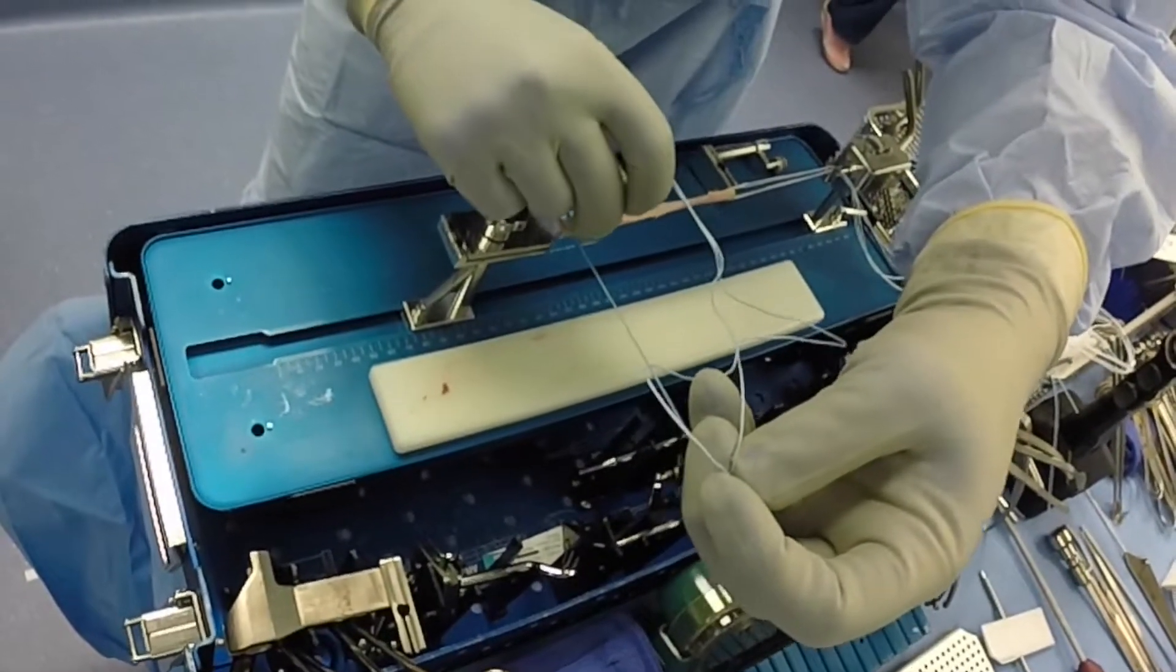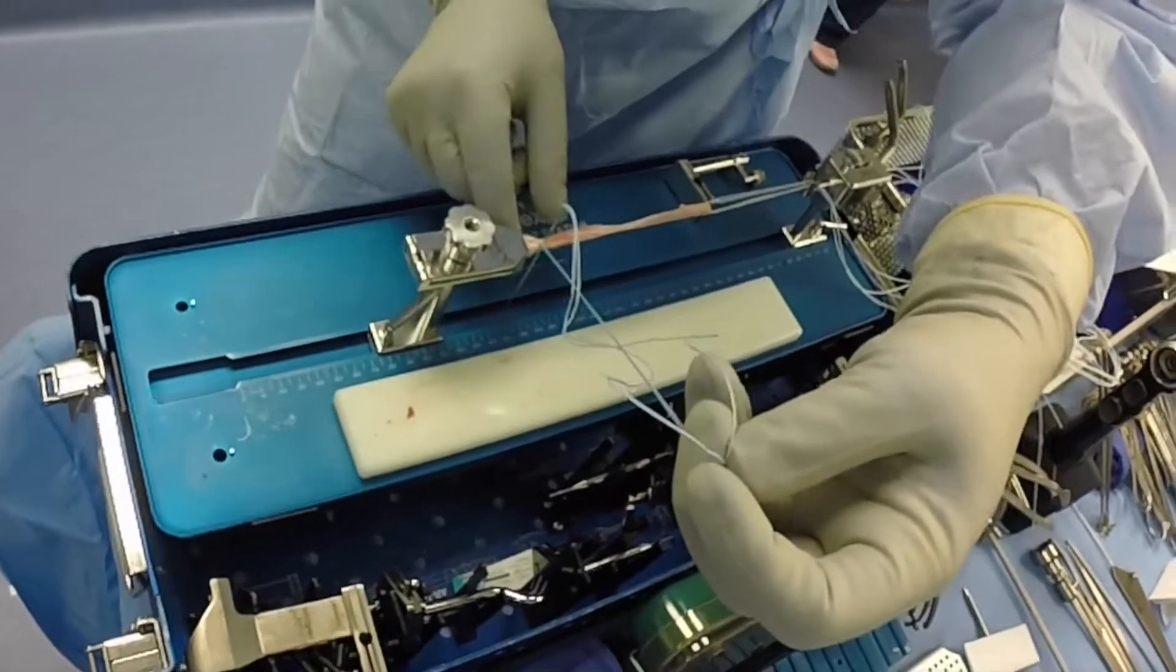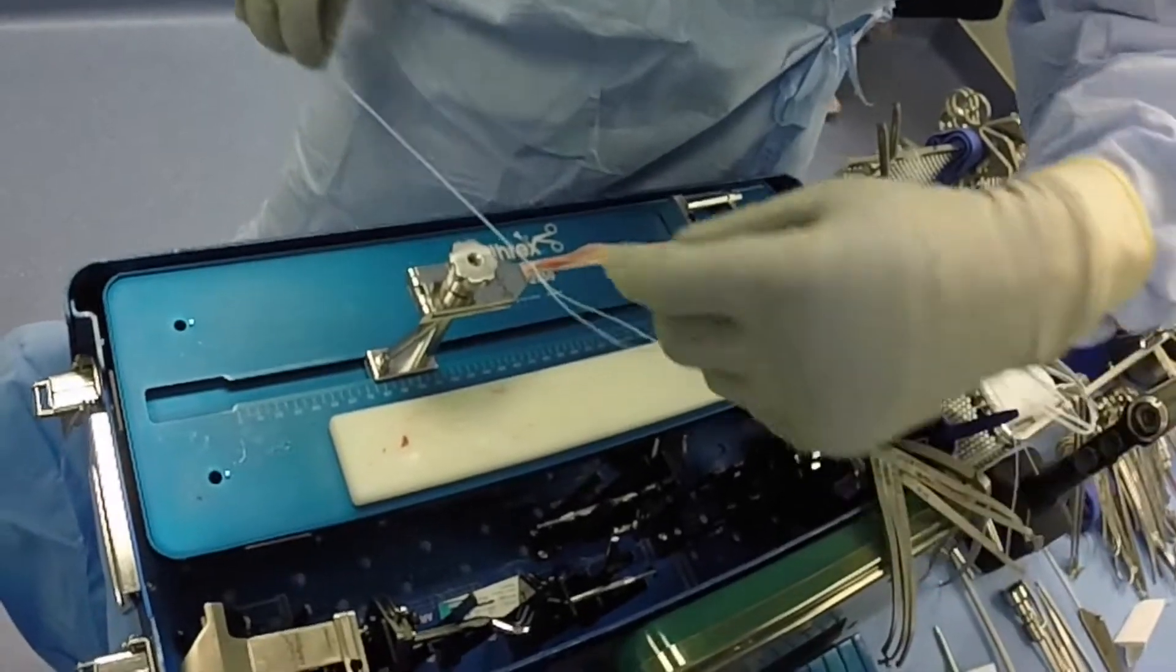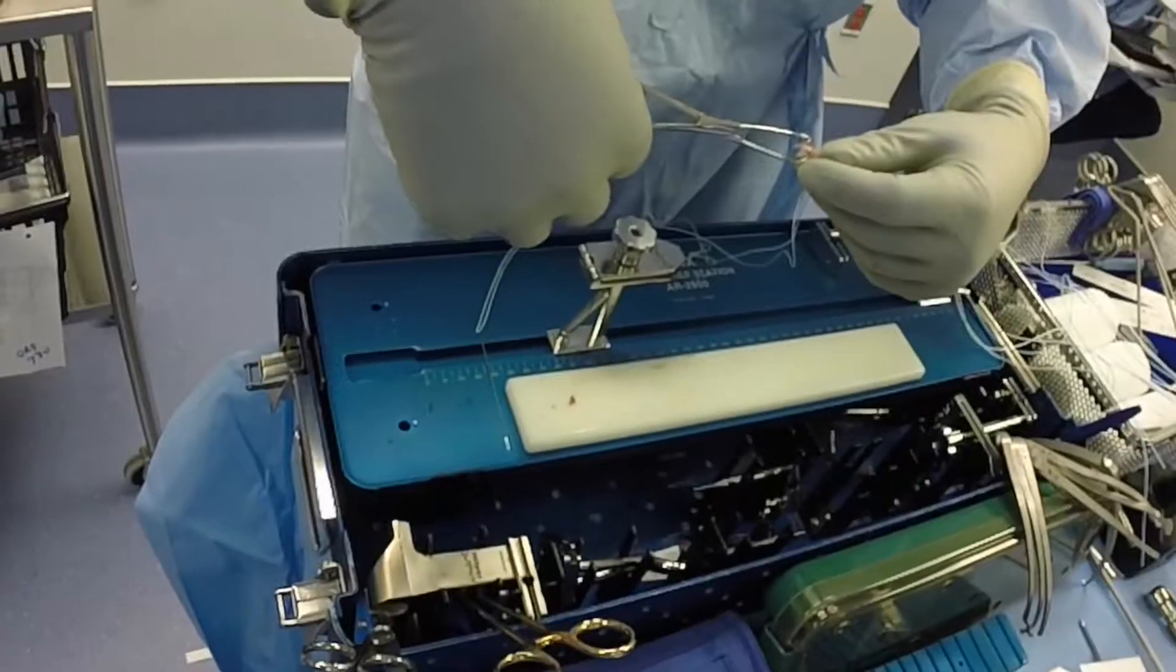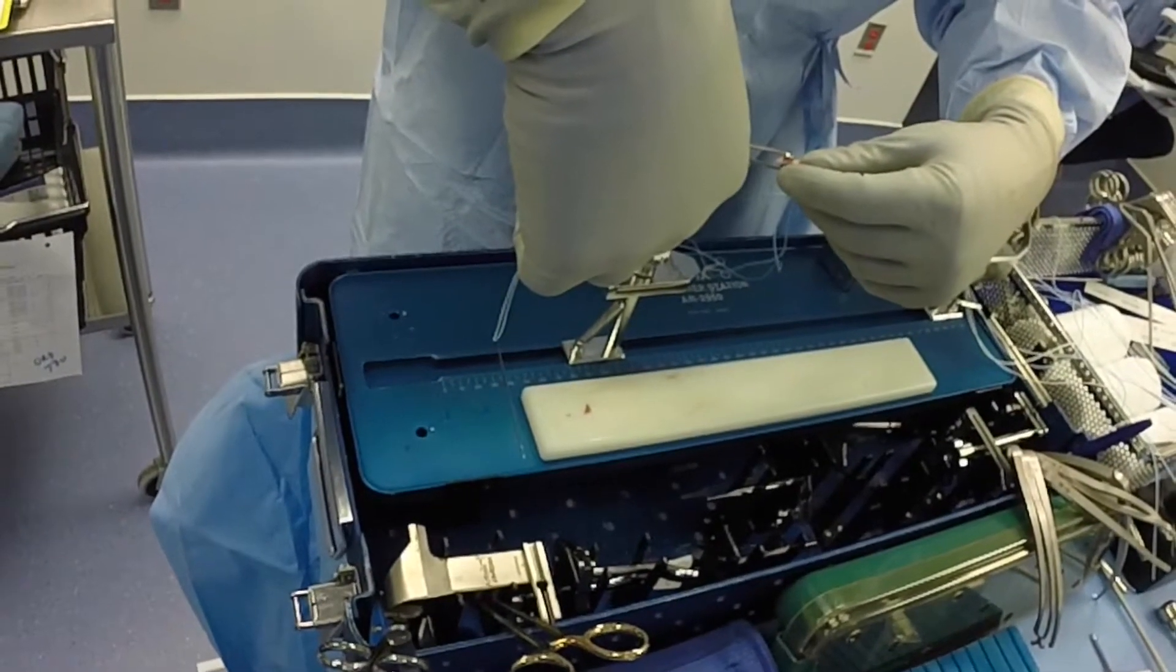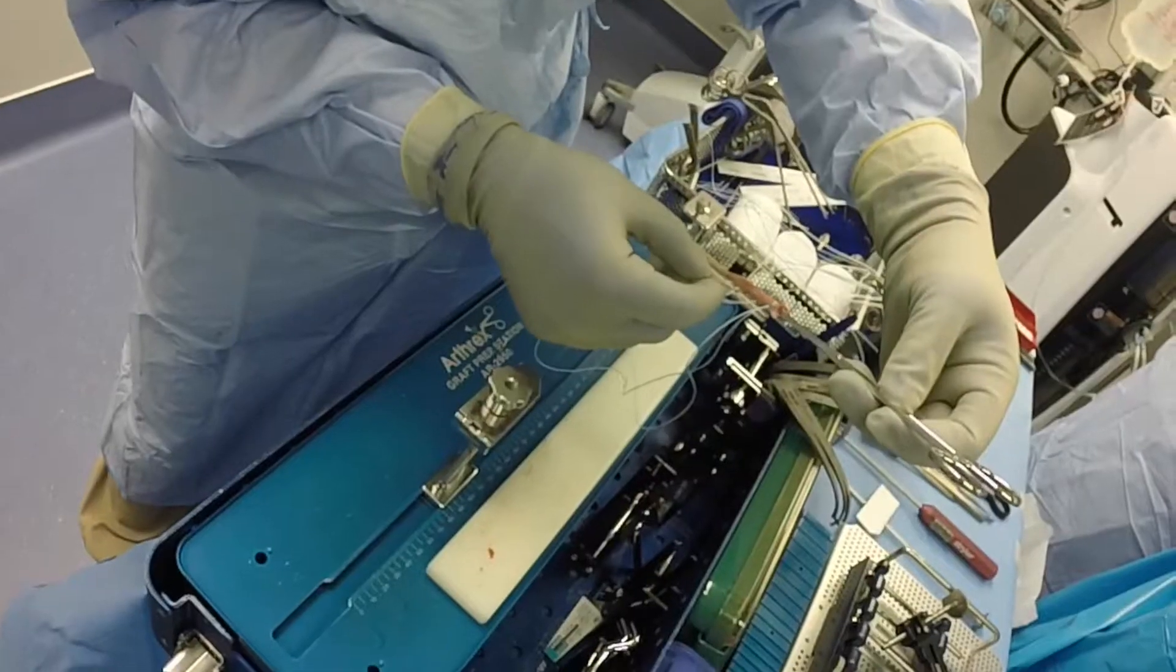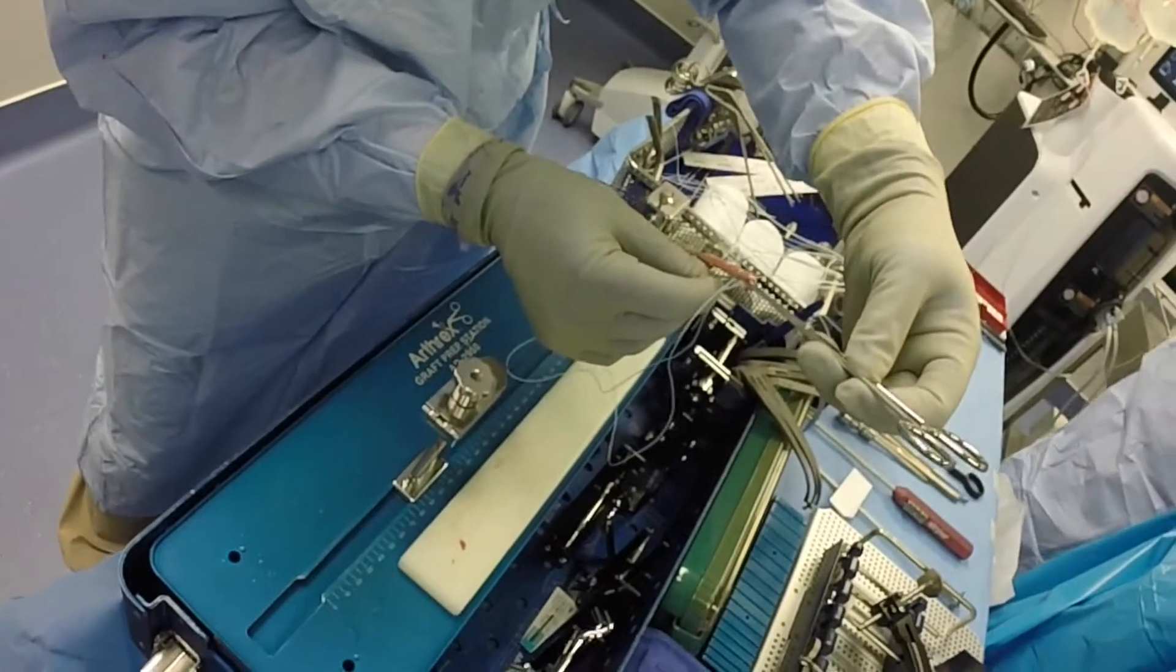And then back-passed through both tendons on the end closer to the tibial TightRope in a loop-and-tack fixation fashion, which is as strong as a five-throw pass which can be done in an alternate fashion.